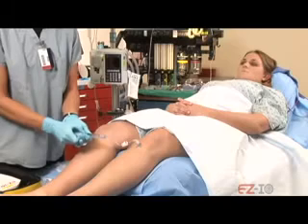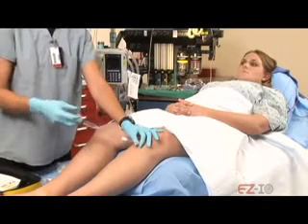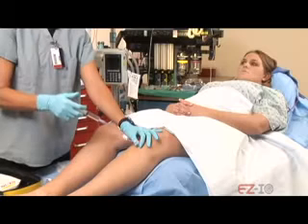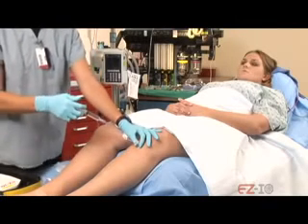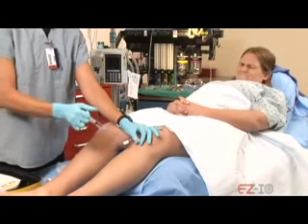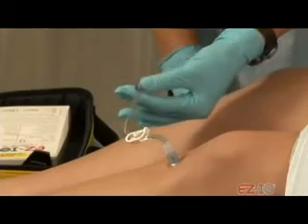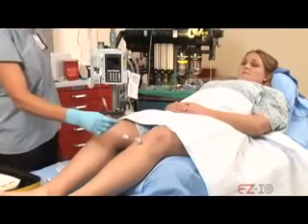Like a 4. Okay. All right, now this next flush needs to go in pretty quick. It's going to take me about 5 seconds, so I'm just going to count down with you. You're going to feel some pressure and some stinging pain when I do that, and then I'm going to be done in 5 seconds, okay? Are you ready? Yes. Okay. 1, 2, 3, 4, 5. Okay? All right. What's your pain level right now? Like a 4. Okay.